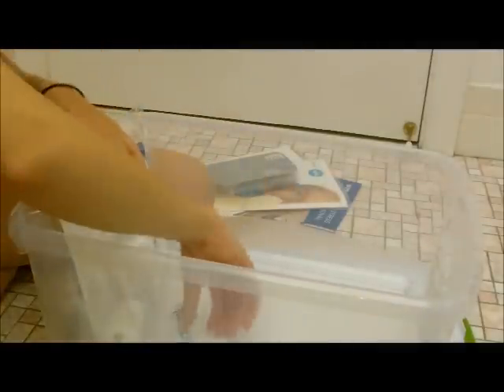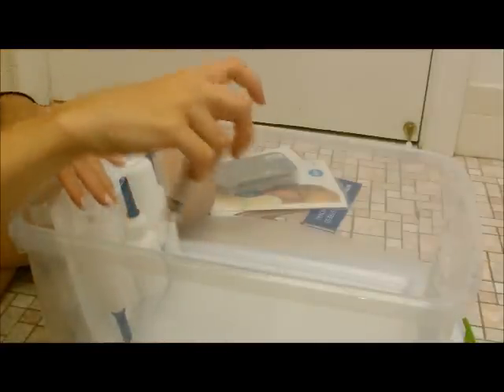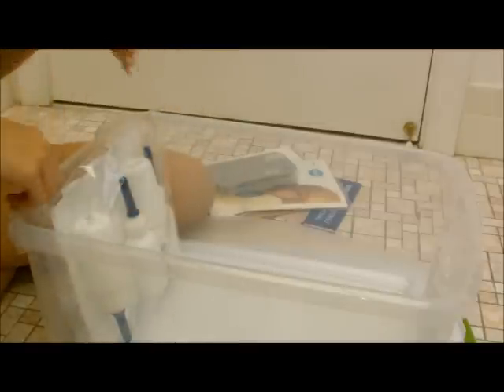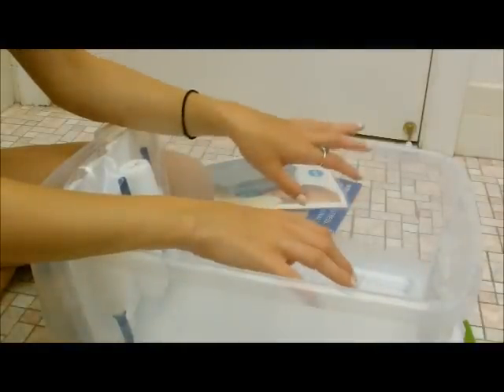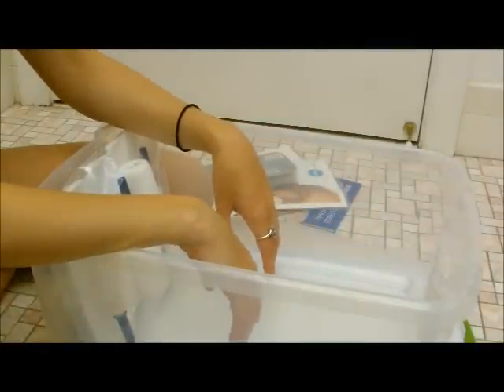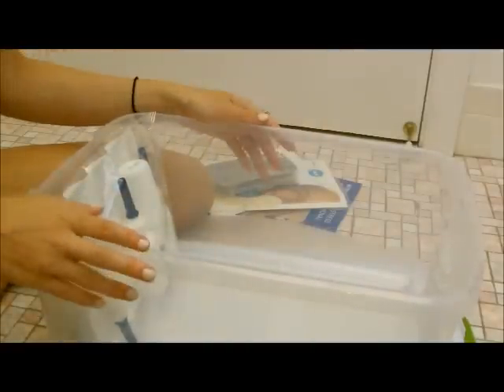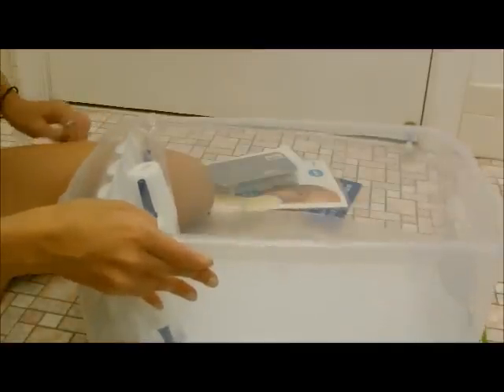And the last few things I have in here have to do with my enemas. I just keep a pack of my steroid enemas in here, and I keep an extra syringe for when I do my Epsom salt enemas. So that is basically my whole box. I eventually want to make a medicine box, and I'll show you that when I get to that. But these are all of my supplies that I take to college, things I really think would be useful to me. Things I use every day with every pouch, and some things that I might use once in a while.